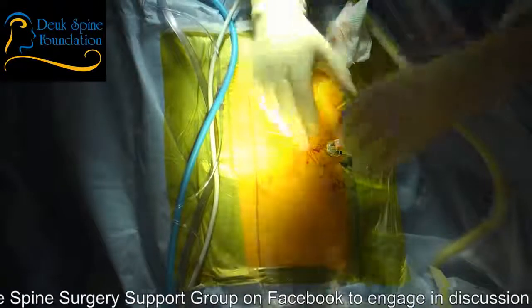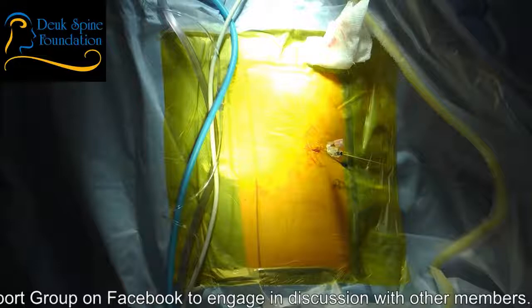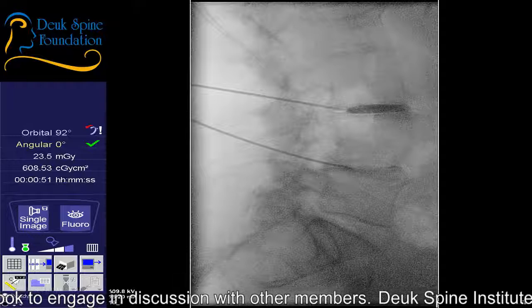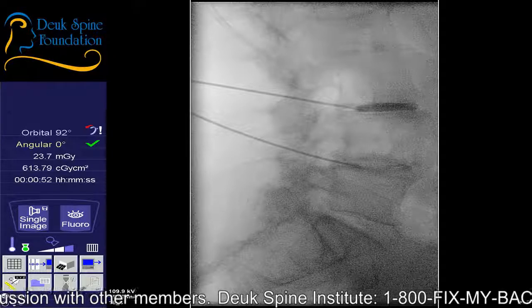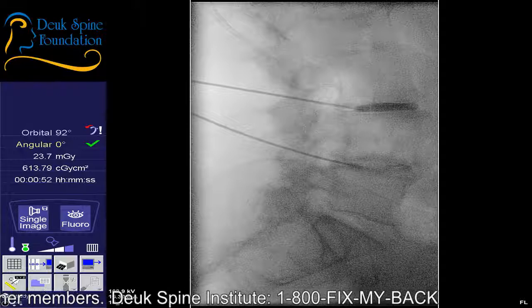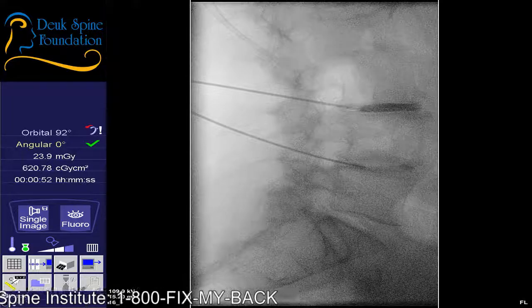All right, so the guide wire, I'm starting at L4-5, and I'm getting the guide wire into the disc, down the needle, and I really want to see the end of the guide wire before I take this needle out. And I haven't seen it yet. So there may just be some bone spur down here, and there is. I can feel it with the needle, with the guide wire. I literally feel it, and that's probably as good as I'm going to get.